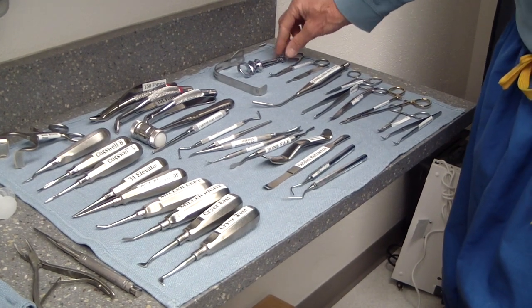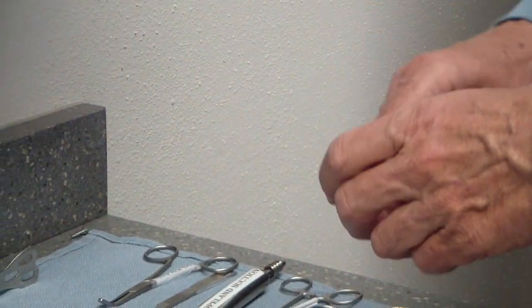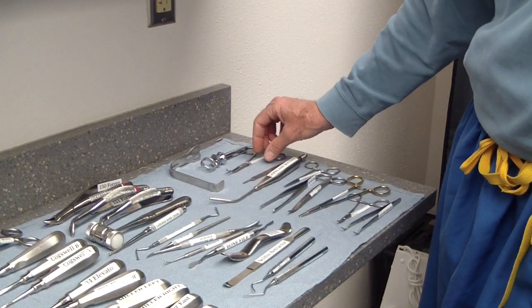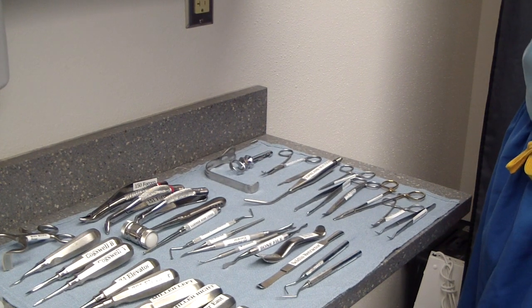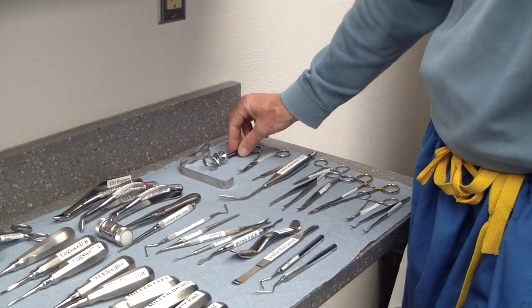We'll go through these in some order. Of course, the first one you always have is your sterilized syringe for anesthesia. One thing here — these are not auto-aspirate, but they do engage so you can aspirate. There are a few different versions. Have you had any experience with the auto ones? No, I haven't used those yet. There's always something new.